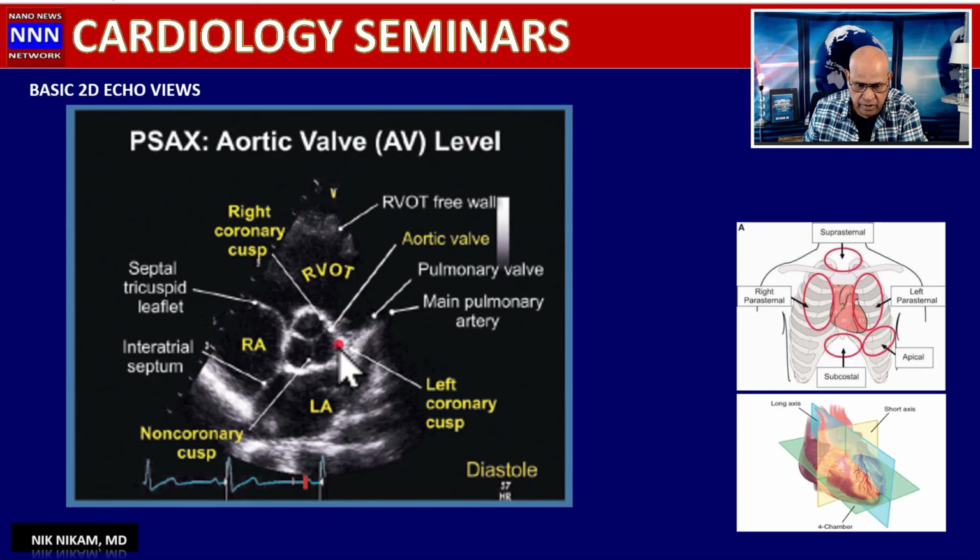We can look at the aorta, we can look for any abscesses or dissection, blood flow through the lumen of the aorta. We can also look for aortic regurgitation with pulse Doppler. Then we'll see sort of a mosaic pattern here that will help us to recognize the aortic regurgitation.